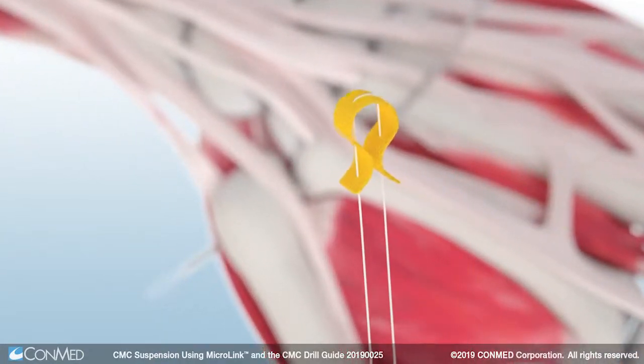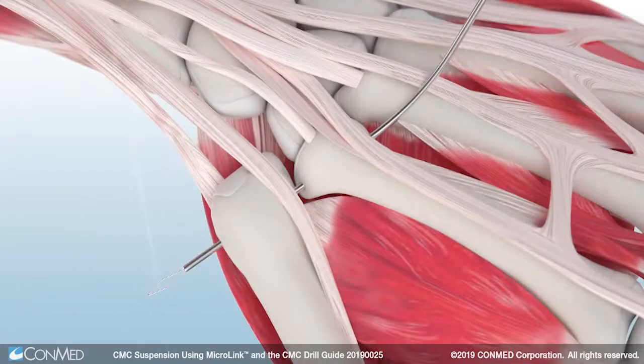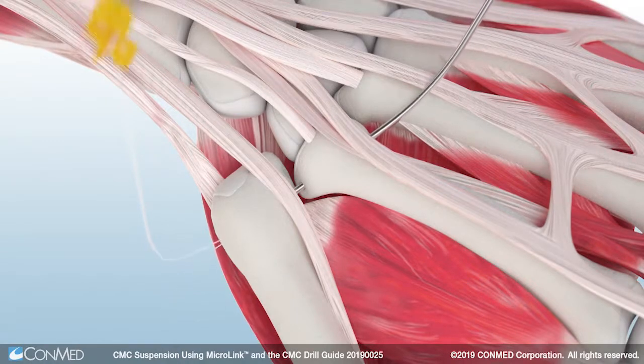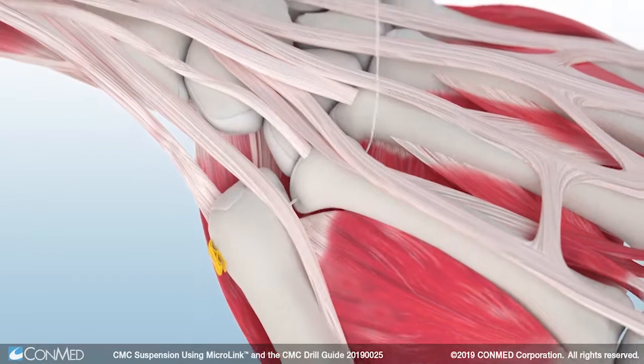Pass two centimeters of the number two hi-fi suture tail found on the Microlink all-suture button through the nitinol loop found on the end of the suture passing drill. Manually pass the suture passing drill through the second metacarpal tunnel until the suture tail has been passed through both the thumb and index metacarpal on the dorsum of the hand.